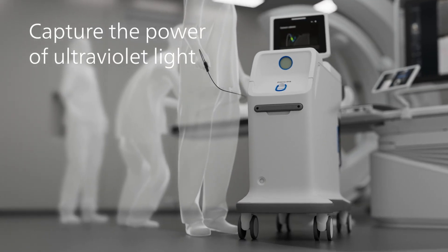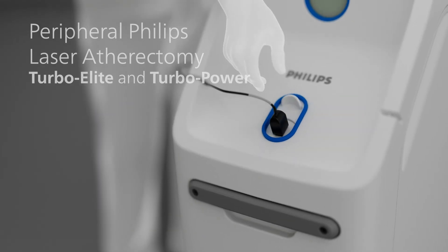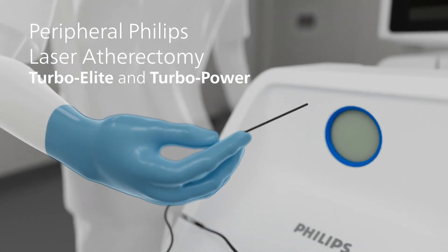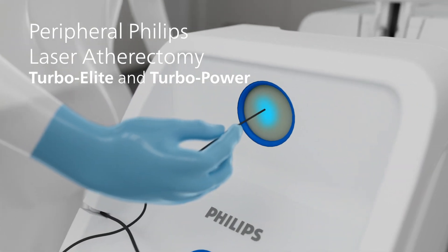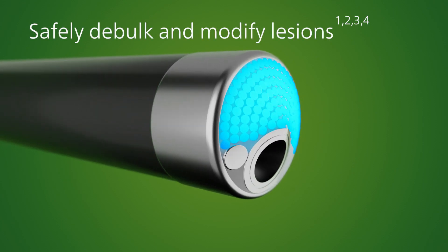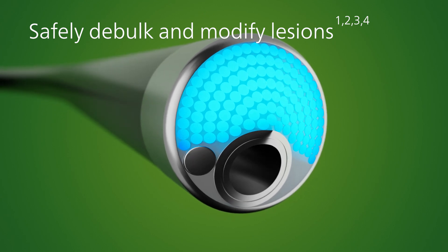Capture the power of ultraviolet light to debulk the most challenging occlusions and restenosis. Peripheral Philips Laser Atherectomy, comprised of TurboElite and TurboPower catheters, is a non-mechanical excimer laser catheter that can debulk and modify plaque in an array of morphologies, including in-stent restenosis.